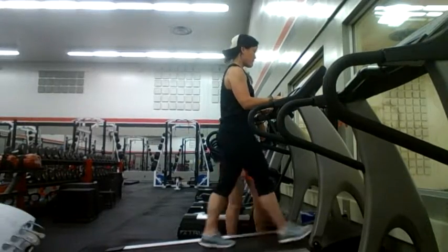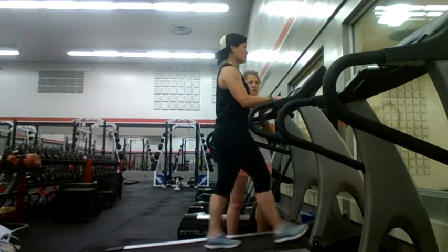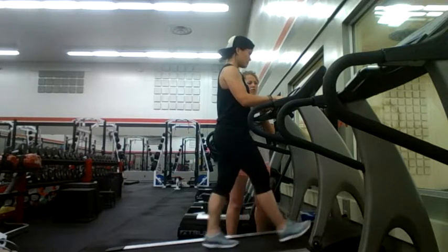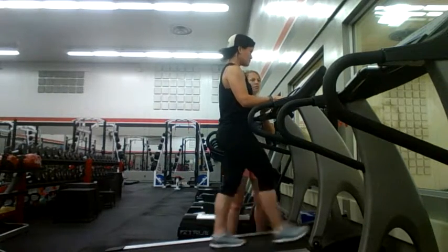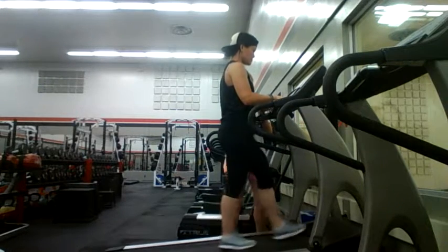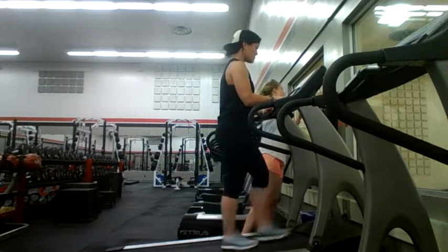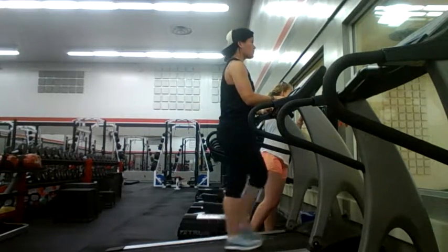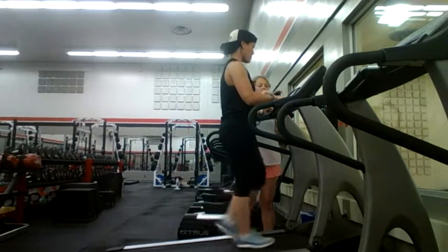We are now performing the treadmill test. We are starting the subject at a speed of 1.7 miles per hour and with a 10% grade. Heart rate will be measured every minute throughout the treadmill test. Once the subject reaches steady state, we will increase the workload. Steady state is reached when 2 consecutive heart rate measurements are within 5 beats per minute of each other.